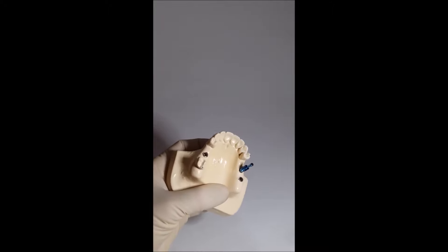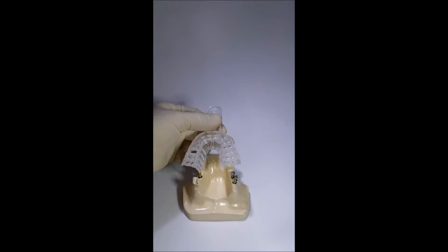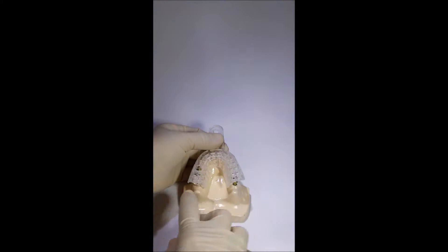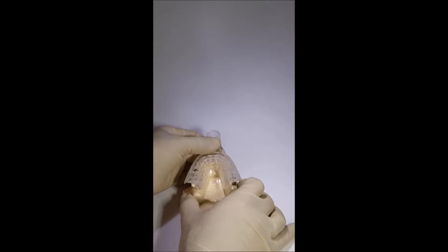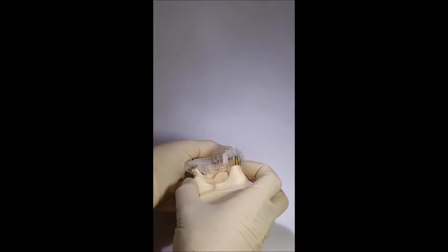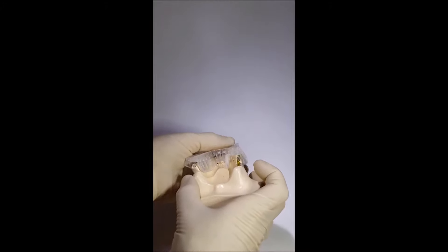Not all transfers meet the challenge equally well. There are two basic techniques for impression taking: the so-called open tray impression technique, when the transfer penetrates through a hole in the tray, and the closed tray impression technique, when the transfer is fully submerged into the impression material inside the tray.